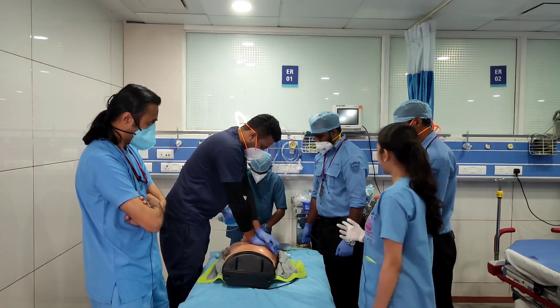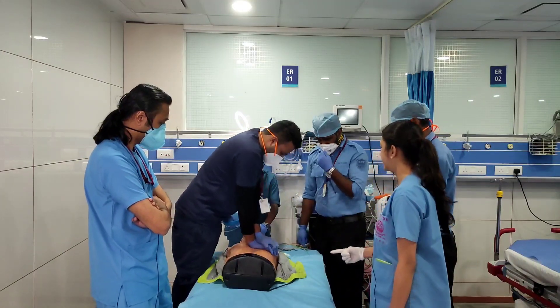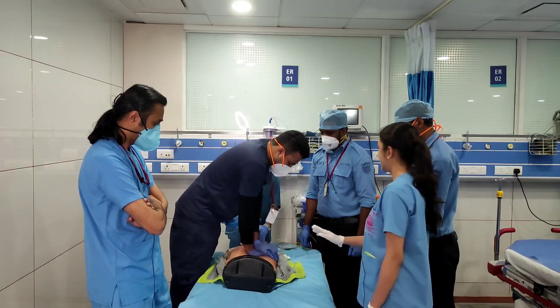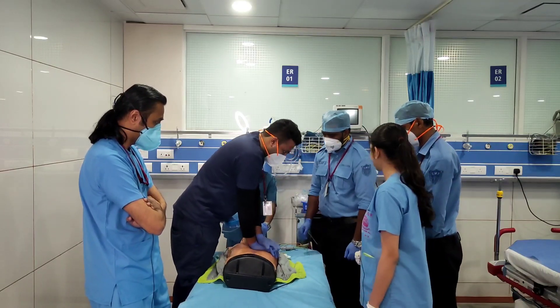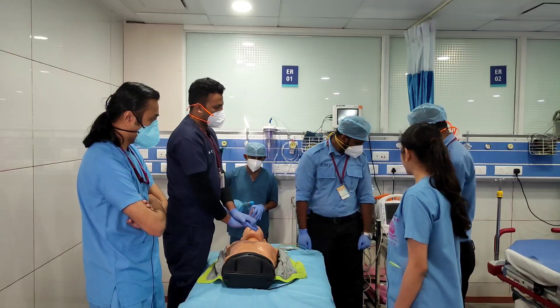Is the cardiac monitor connected? Yes. We will assess the rhythm — everyone clear. We assess the rhythm.